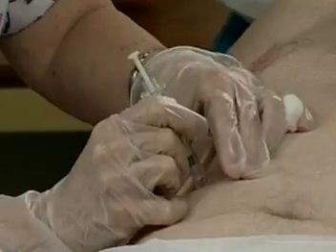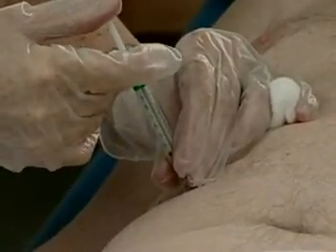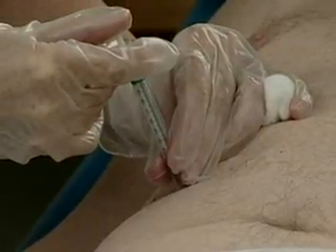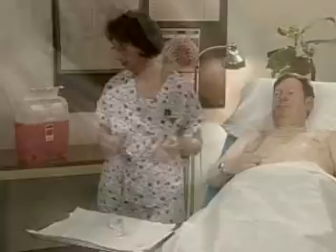Use a smooth darting action to insert the needle at a 90-degree angle in the middle of the pinch. Release the pinched tissue, stabilize the syringe, and inject the medication. Withdraw the needle, cover the site, and massage. Safely dispose of the syringe.